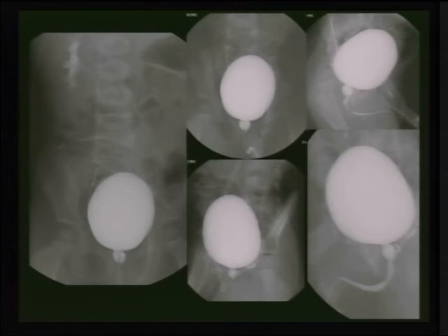Another example of a male with Hinman syndrome, and you can see the dilated posterior urethra and intermittent micturition. The bladder is not as bad in trabeculation as the other one, and it is associated with reflux, and there is reflux into the seminal vesicle. You can see it in the last image on the right.